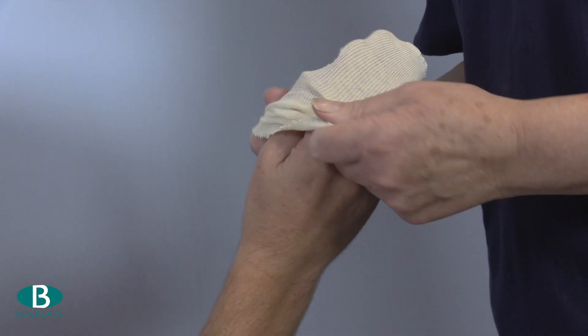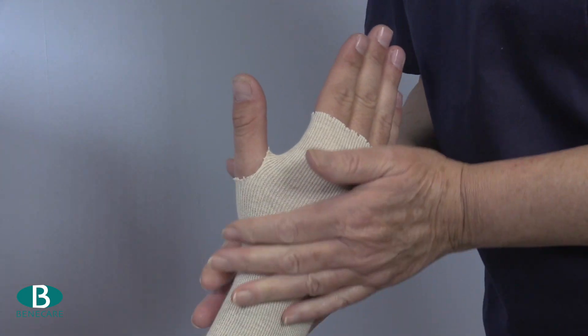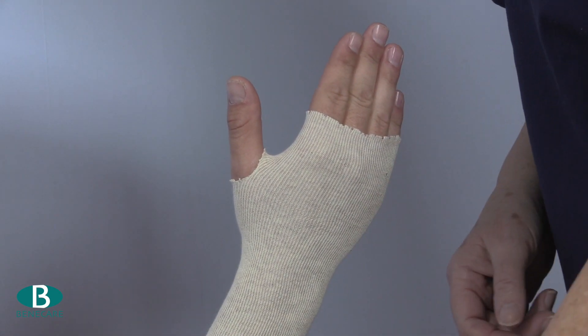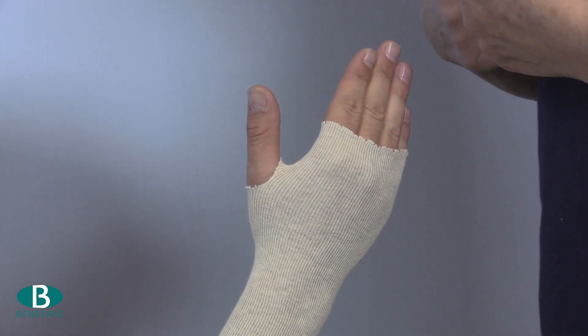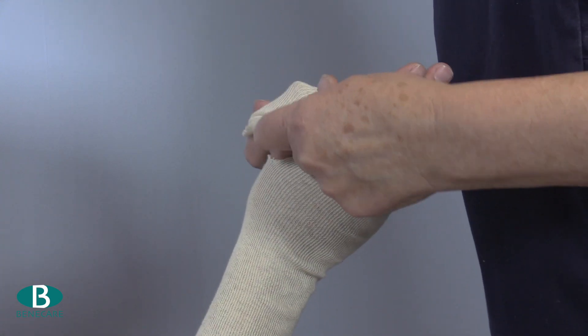Using the 5cm stockinette, cut a small hole for the thumb approximately 7cm from the end and place it directly onto the limb with the thumb through the hole. Then repeat this process with the second piece of stockinette. Ensure this is wrinkle free.